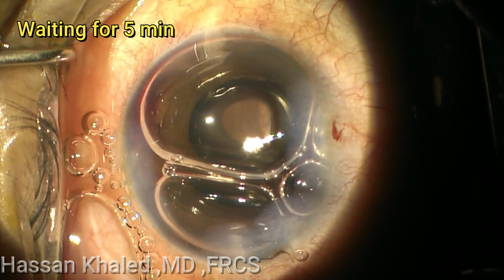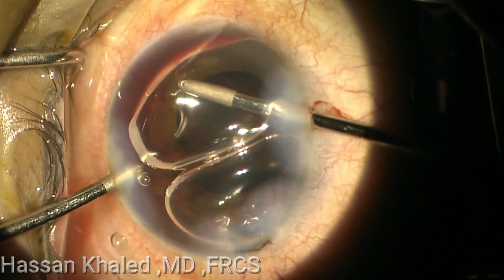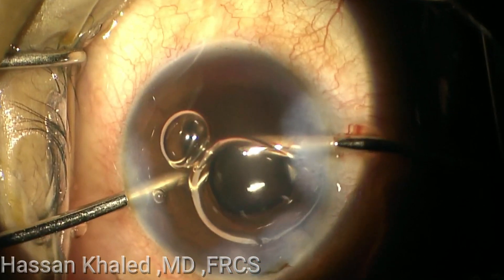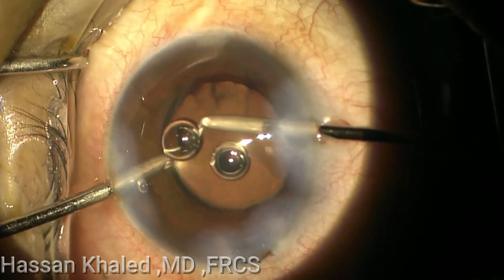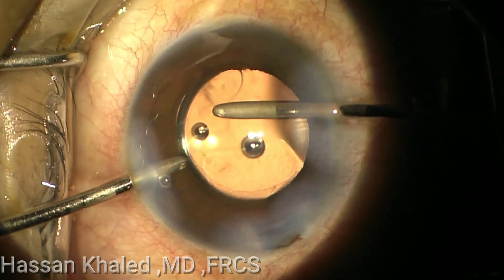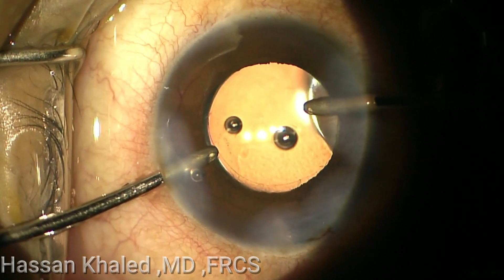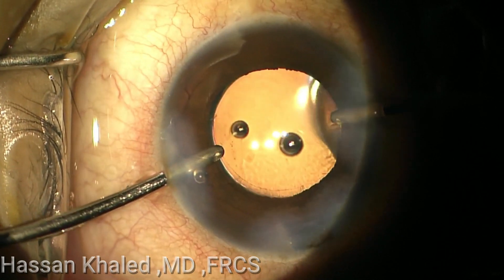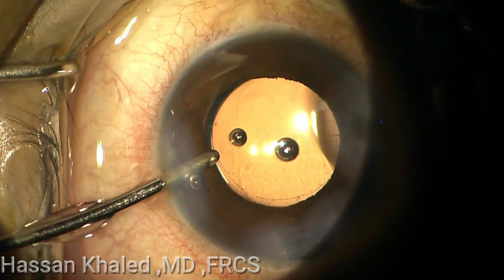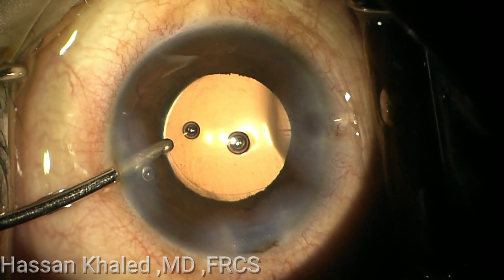I wait for about five minutes. Then I go in manually to remove the bleeding gently, trying not to cause any turbulence inside the anterior chamber. But you can see the bleeding did not stop. Then I keep the irrigation inside the anterior chamber and complete stromal hydration for the paracentesis.